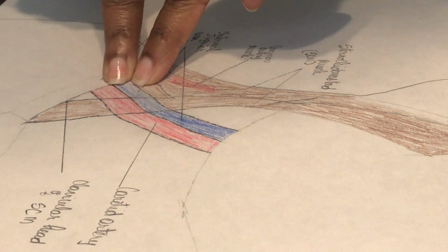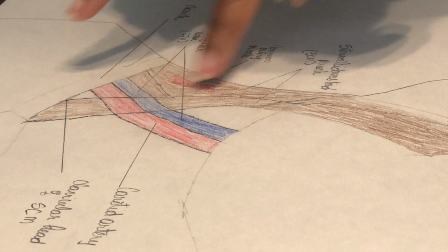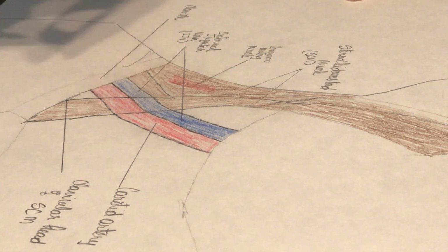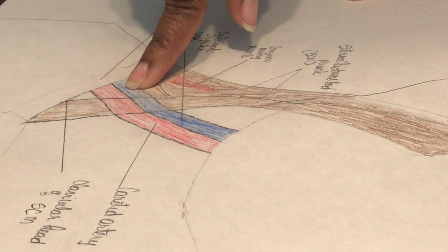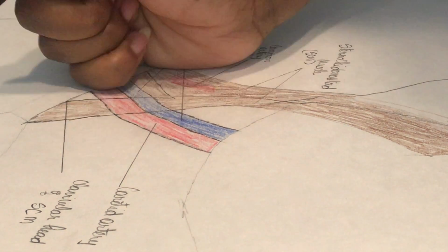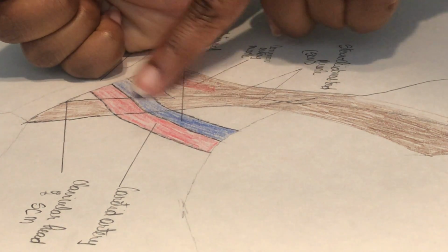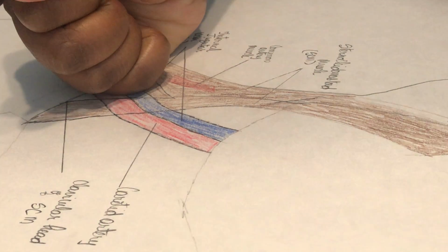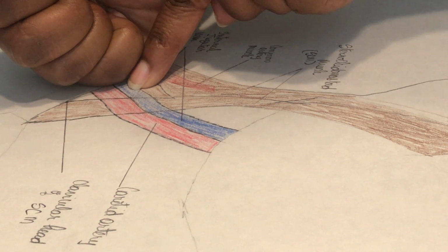This is the site where we're going to insert the catheter, and it's located in that triangle section. This is the jugular vein, and this is the carotid artery. The carotid artery is very close to the jugular vein, but the difference between the two is that the jugular vein is very compressible. So we use our ultrasound machine, we locate, and we do the long and short axis. The long axis lets us see the state of the vessel. Once we look at our vessel, we can mark it down with a surgical pen. Of course, it has to be a sterile surgical pen.